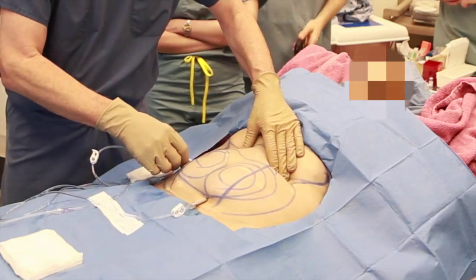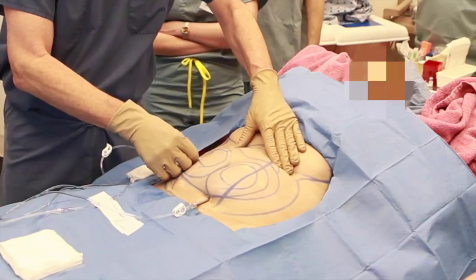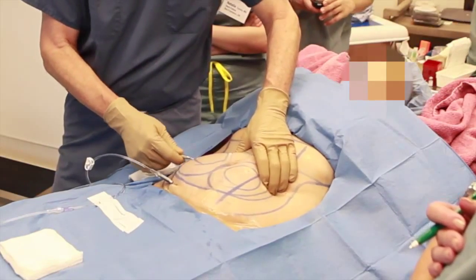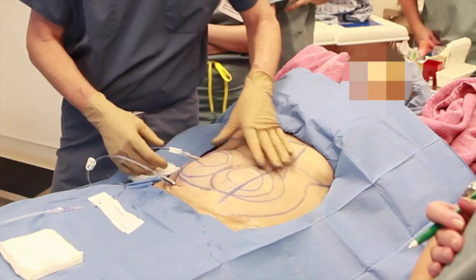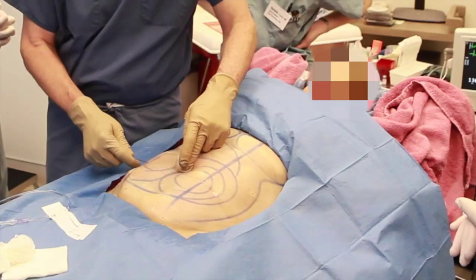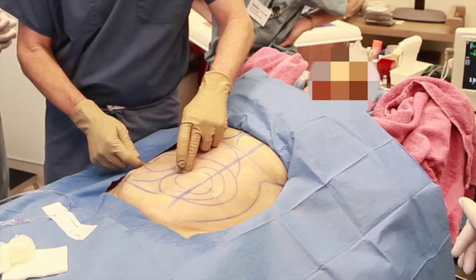This is basically a painless procedure because the lidocaine has already been infiltrated somewhat with the spinal needle. So we can insert these blunt-tipped 16-gauge cannulas with virtually no discomfort, and we continue to infiltrate using the peristaltic pump.